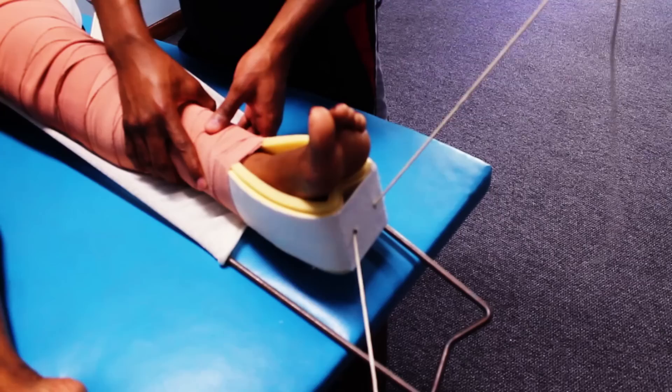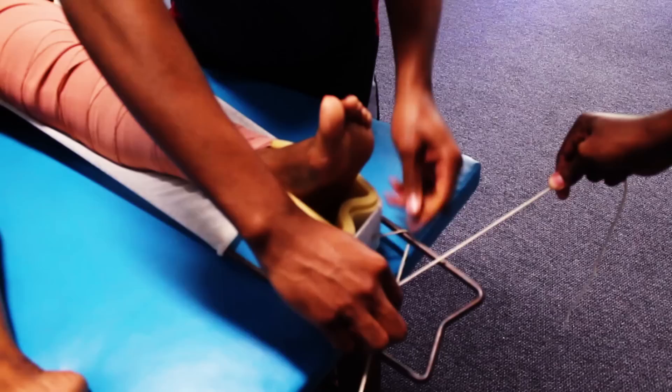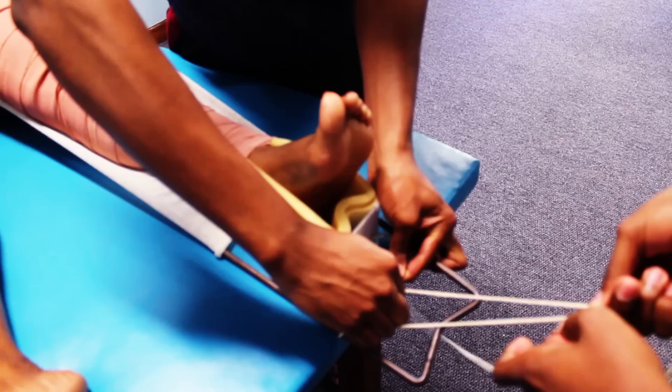The foot lies in external rotation in femur fractures, and we want to reduce it to internal rotation. We can achieve this by putting the inner string under and the outer string over, then tying a reef knot to secure it. Your assistant can help you to secure the knot.